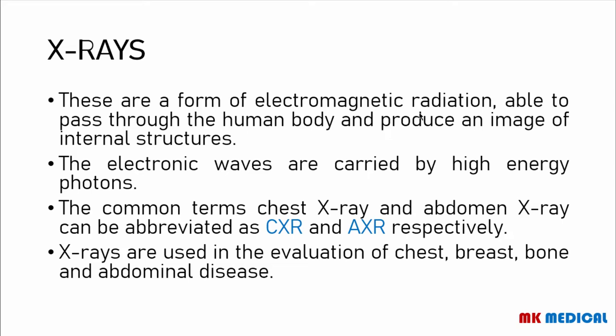So there are some common terms that are used to denote chest X-rays as well as abdominal X-rays. We use CXR to denote chest X-ray, and we use AXR to denote abdominal X-rays. Remember that these abdominal as well as chest X-rays are going to be used in the evaluation of many diseases affecting the chest, diseases affecting the breast, diseases affecting the bones as well as the abdomen.